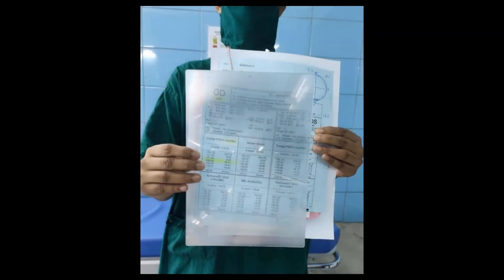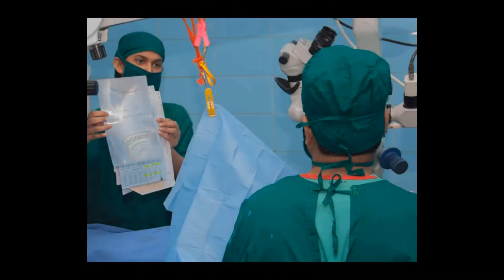Magnifier screen. Magnifier screen is a simple tool that can be used to read fine prints of automated printouts and match IOL labels before cataract surgery without using presbyopic glasses by surgeons, thus making the time out before a surgery more convenient for the surgeon.